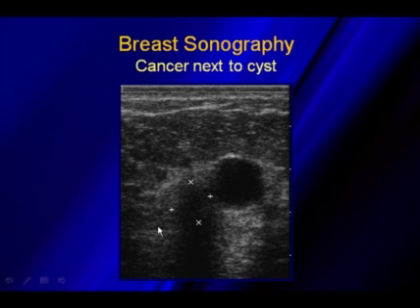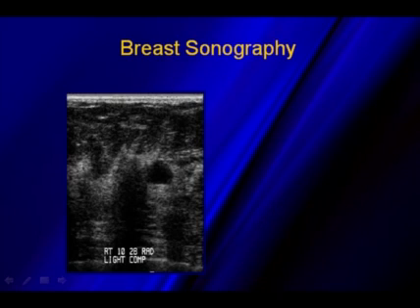up else in the breast, but you can see this area, small breast cancer, sitting right next to the cyst with intense shadowing behind it. Now, with breast ultrasound, a lot of times we become very tunnel vision. We see these really small cysts in there, we're trying to clean them out, we're trying to show the through transmission and good posterior borders and enhancement, and we become so tunnel vision that we take a picture that looks something like this. This looks just like the cancer I showed you sitting next to this cyst.